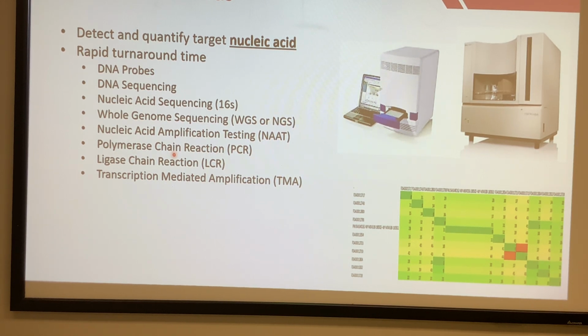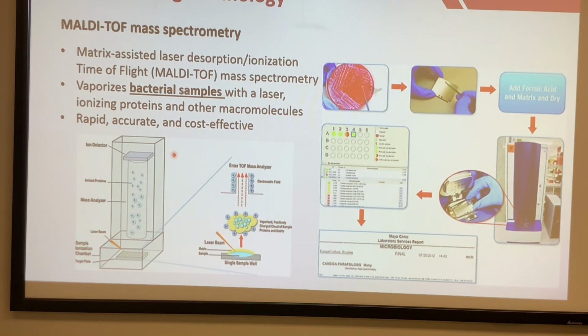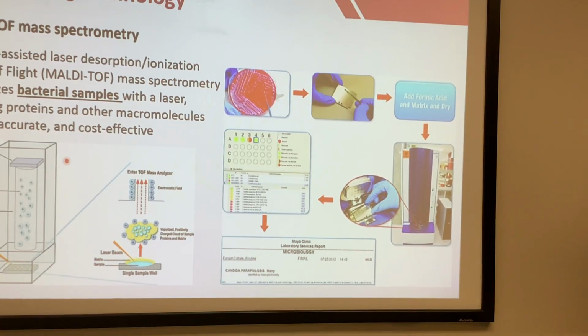So for studying purposes, I want you to get familiar with each. I'm not expecting you to remember the names, but understand how you can use them. I do want you to understand what you're targeting when you're talking about molecular testing. Okay? So the one that's underlined actually is the one. I also want you to make sure you understand your targets have different nucleic acid or genetic information. When you're dealing with COVID, you're actually detecting RNA, right? When you're dealing with bacteria, you're detecting DNA. Okay, so this is one thing I do want you guys to know.